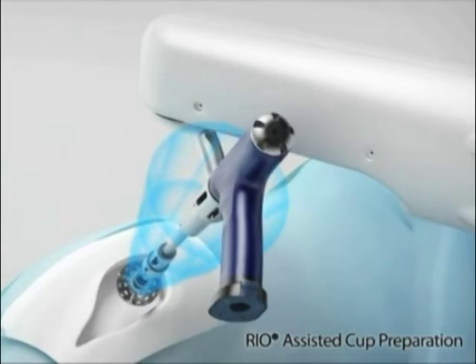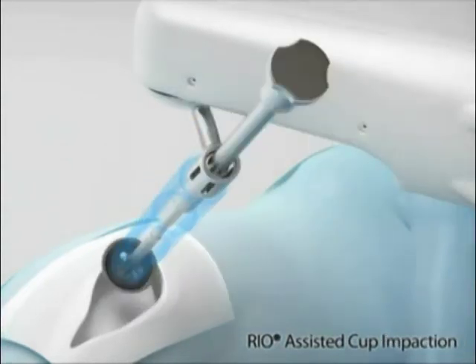And this light blue that you see there is the haptic tunnel for the reamer, and if we look at the haptic tunnel for the cup, you see it's much tighter. So you've got a 10-degree margin for the reamer. You're just trying to form a hemisphere, so you've got a little error, a little play there before you make an error, and if you make an error, it'll stop.